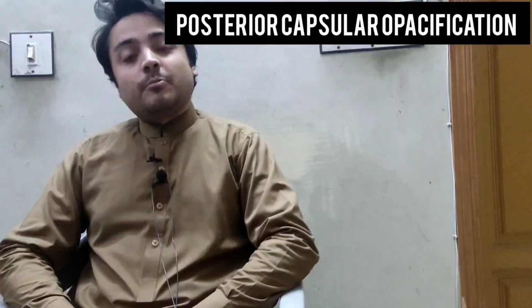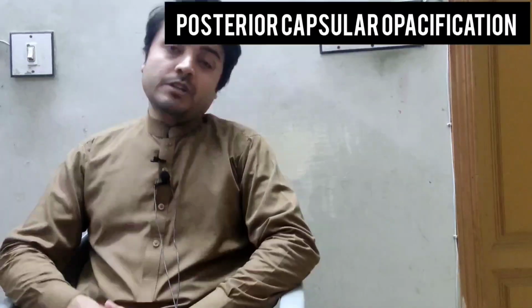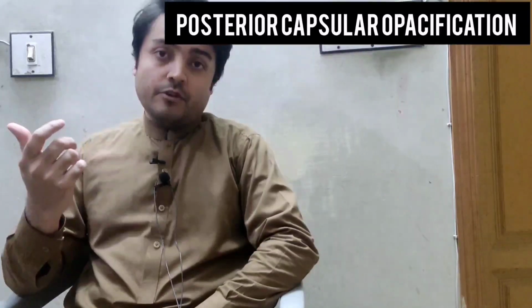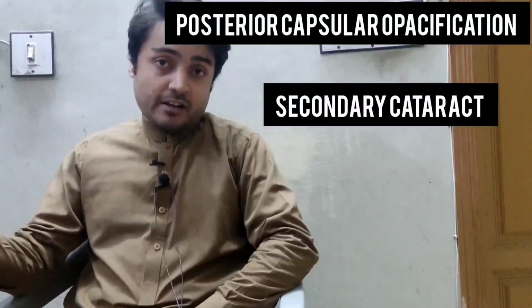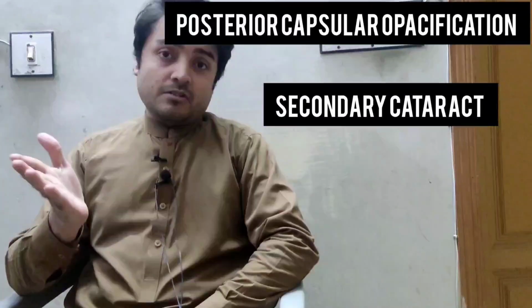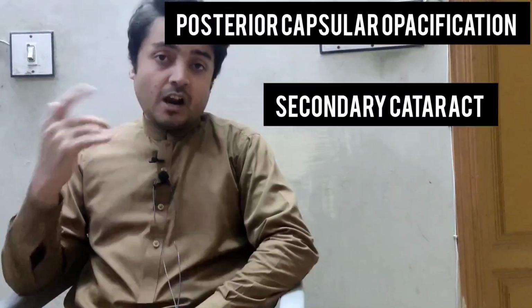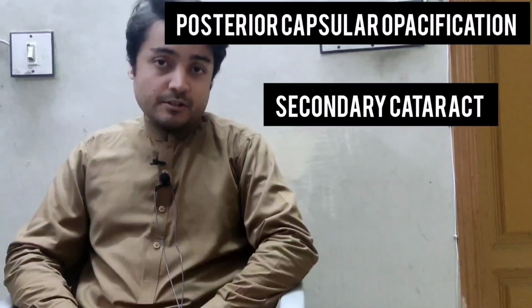Posterior capsular opacification. In this video we are going to discuss this, and another name for it is a second cataract or secondary cataract. This is the main cause of the same blurriness or haziness in the field of vision after a patient has undergone cataract surgery. Before starting the video, I'm going to show you a small video in which I'm going to show you the equipment, the YAG Laser Capsulotomy equipment that is used to treat this, and then we'll proceed.